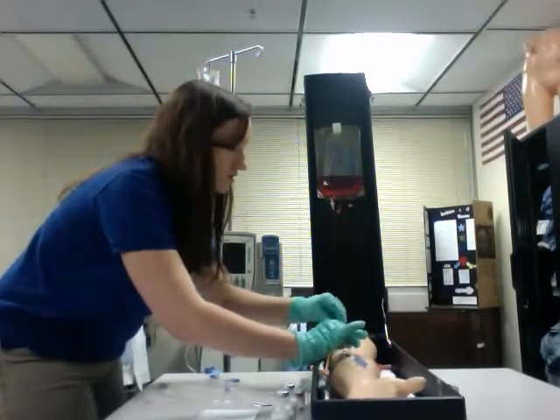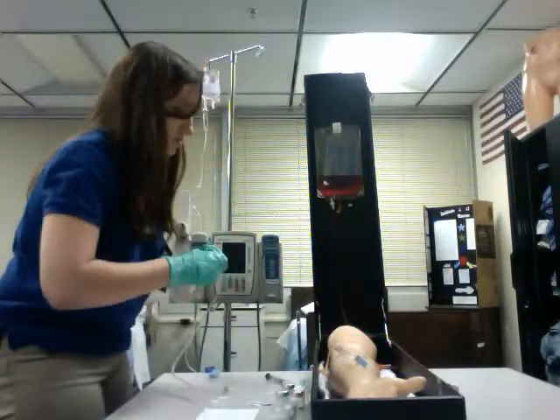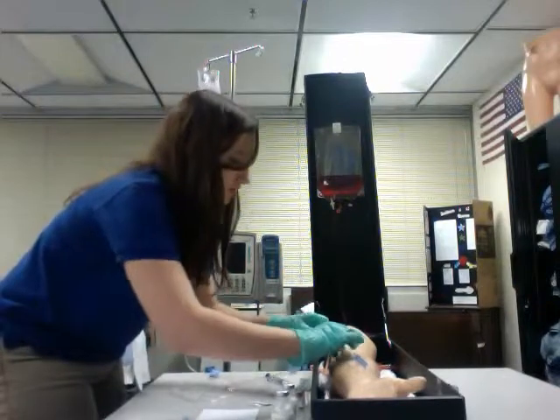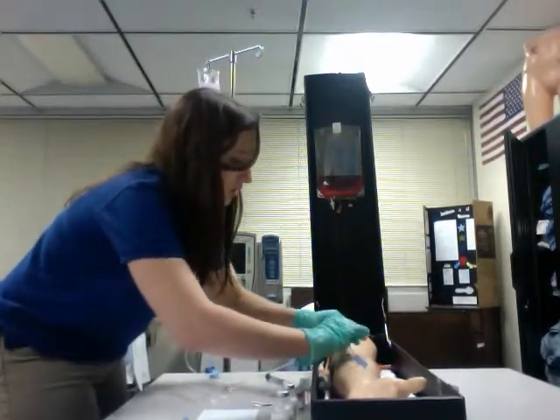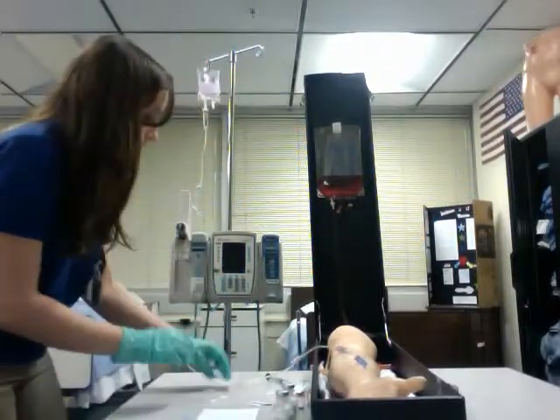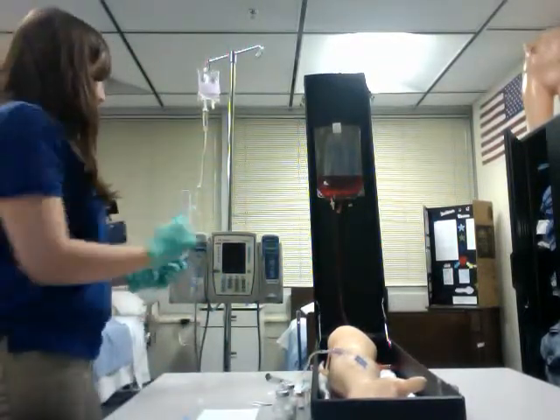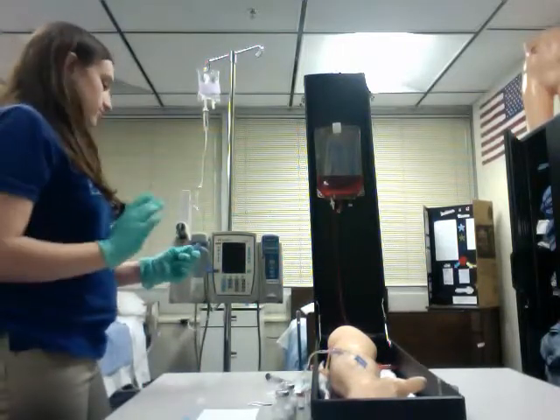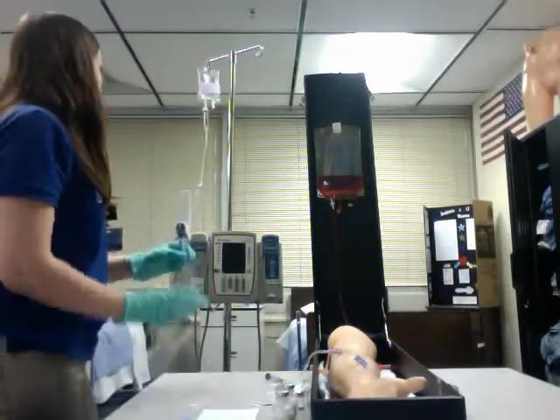Alright, sounds good. So now I'm going to go ahead and connect my medication. Alright, the medication is connected. So now I'm going to go ahead and unclamp my tubing and set the flow rate and everything, which will be 100 milliliters an hour. That way it uses over 60 minutes. Make sure that everything is flowing correctly.